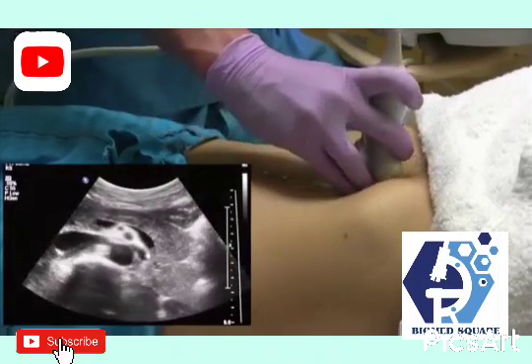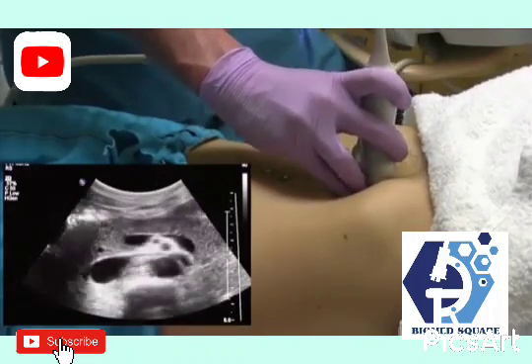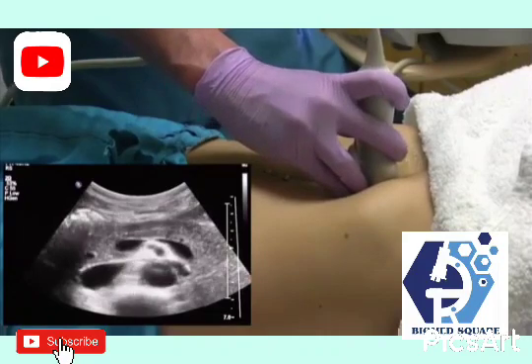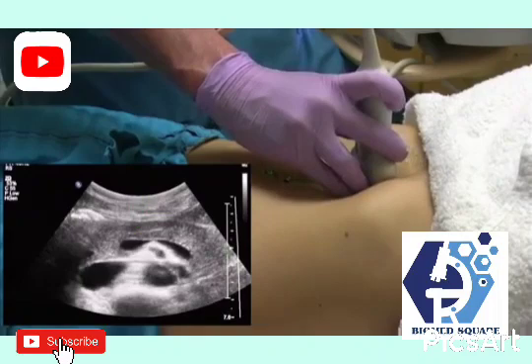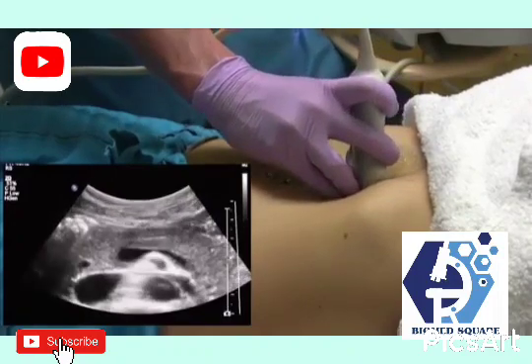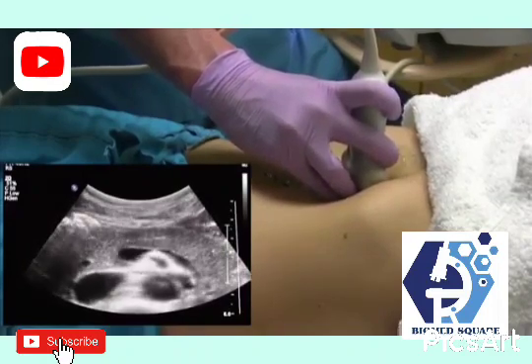When you're looking at the pancreas, you want to look for certain structures in the pancreas as well. One of the structures that we can look for is the pancreatic duct, and that runs right through the body of the pancreas, throughout the entire length of the pancreas, let's say. And you can look here. A lot of patients, you will be able to see the pancreatic duct, and we usually use 2 millimeters as a cutoff for our normal pancreatic duct measurement.